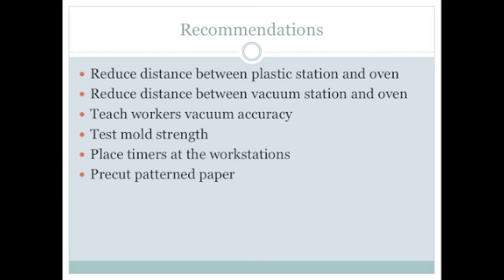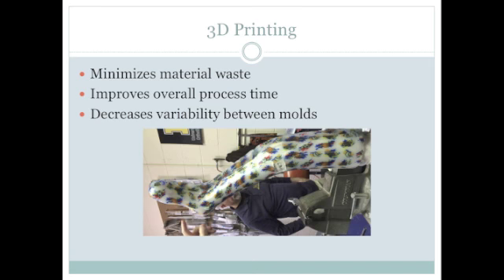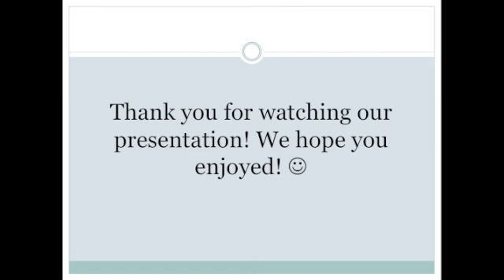Overall, using the tools we have learned throughout IOE 463, our team has provided great information for ways to minimize waste and maximize productivity at the prosthetic and orthotic clinic. As a final deliverable to our project, our team did research into a second potential process utilizing 3D printing. Using a 3D printer to create an AFO would eliminate a majority of the material waste, improve the overall process time, and decrease the variability between molds. We hope you enjoyed learning about orthotics as much as we did, and thanks for listening to our presentation.